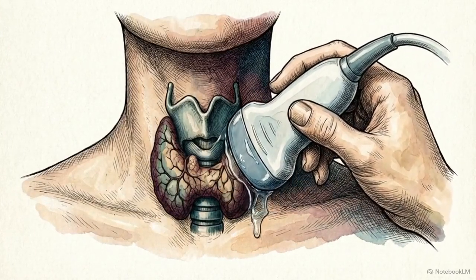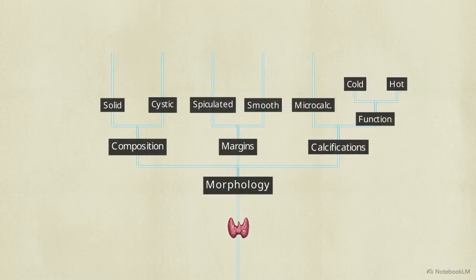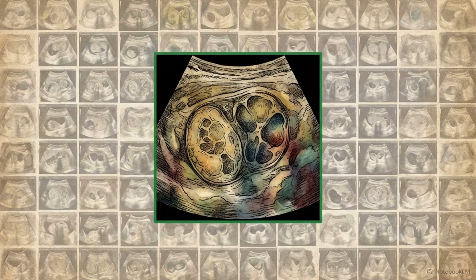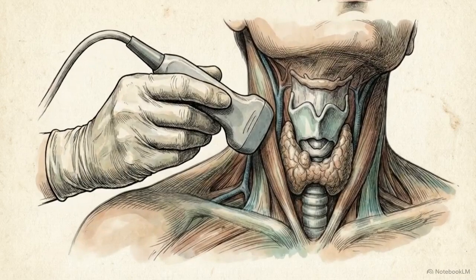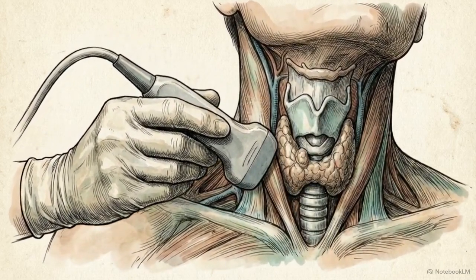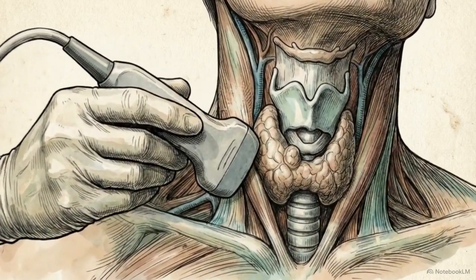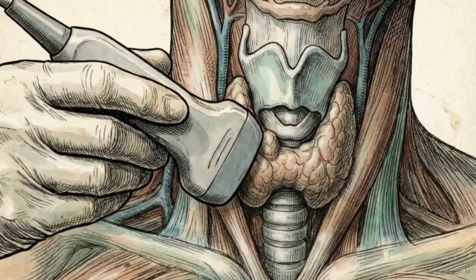to unnecessary invasive biopsies. Diagnostic imaging of the thyroid therefore requires a strict triage algorithm. Radiologists must apply precise structural and functional filters to tune out the overwhelming biological noise and isolate the rare true malignancies. The first analytical filter is morphology, captured via ultrasound. Radiologists evaluate specific features, margins, composition, vascularity, and calcifications to assign a risk stratum to every identified nodule.